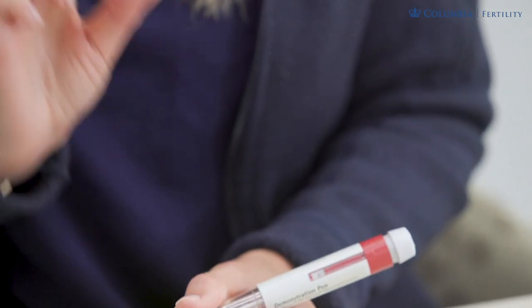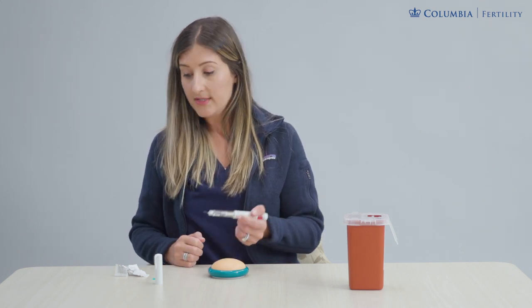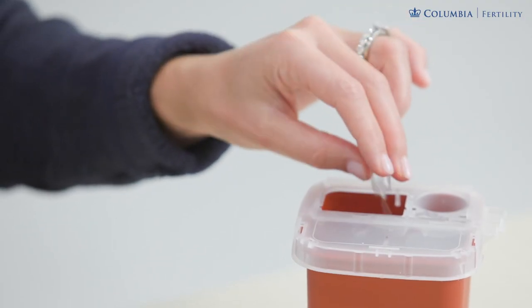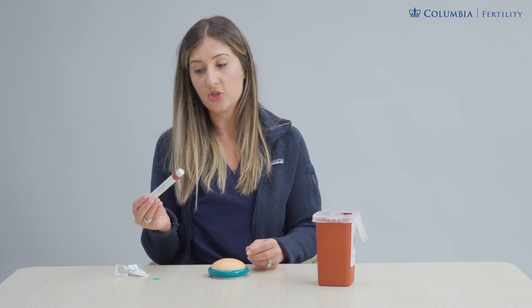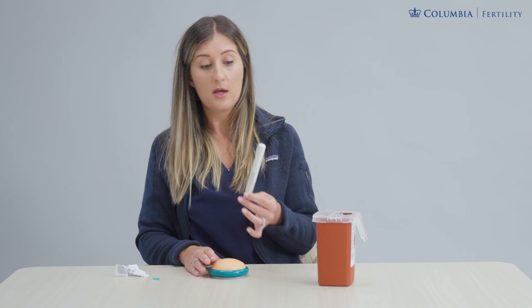Take the needle tip and carefully unscrew it from the pen, then drop it into your red sharps container. Recap your pen and, if it was kept cold, put it back in the refrigerator, or you can leave it out at room temperature. Remember, it is a multi-dose pen, so don't discard it after just one use.